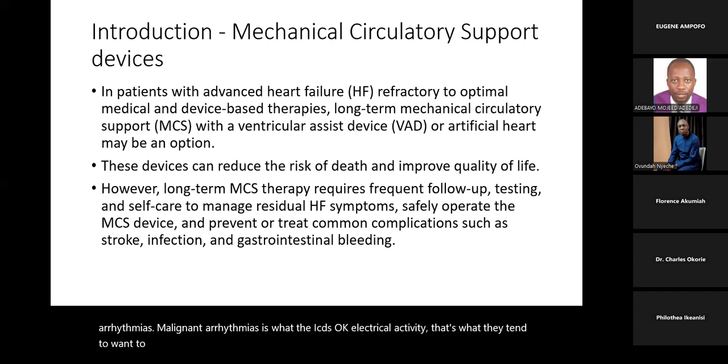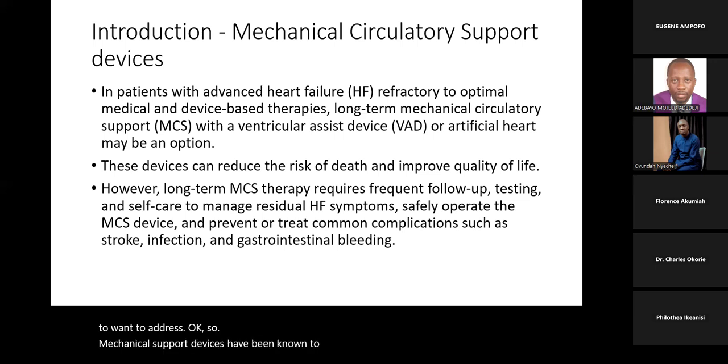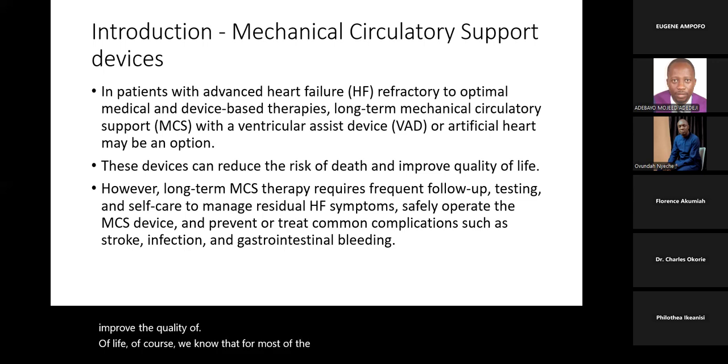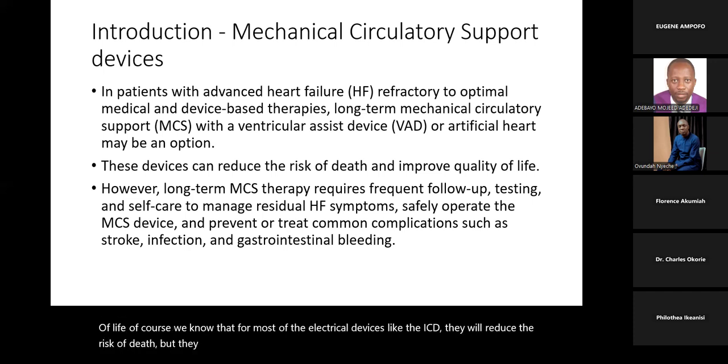Okay, so mechanical support devices have been known to reduce the risk of death and also improve the quality of life. Of course, we know that for most of the electrical devices like the ICD, they will reduce the risk of death, but they may not improve the quality of life.